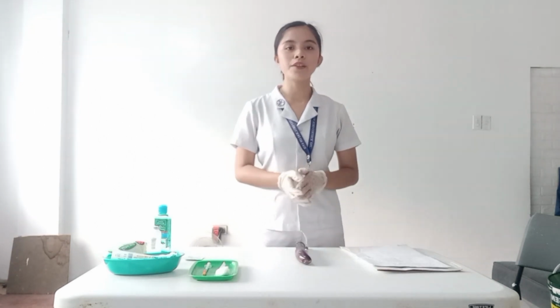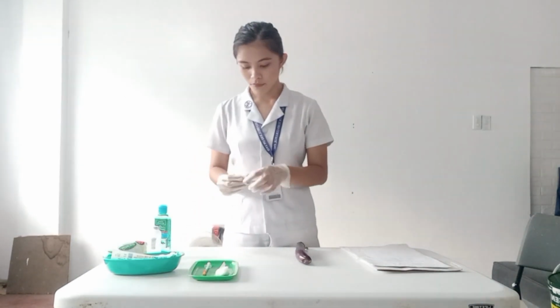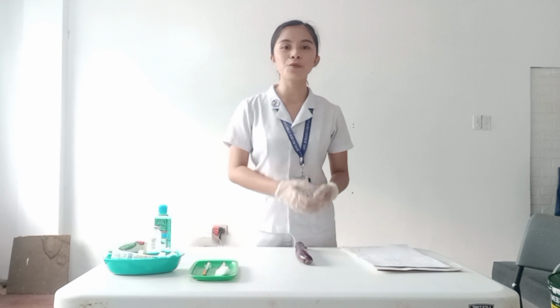Now clean the site with an antiseptic swab, starting at the center and cleaning in a widening circle to about 5 centimeters. This removes skin secretions which contain microorganisms. Now place and hold the swab between the third and fourth finger of the non-dominant hand, or position the swab on the client's skin above the intended site. Using this technique keeps the swab readily accessible when the needle is withdrawn.